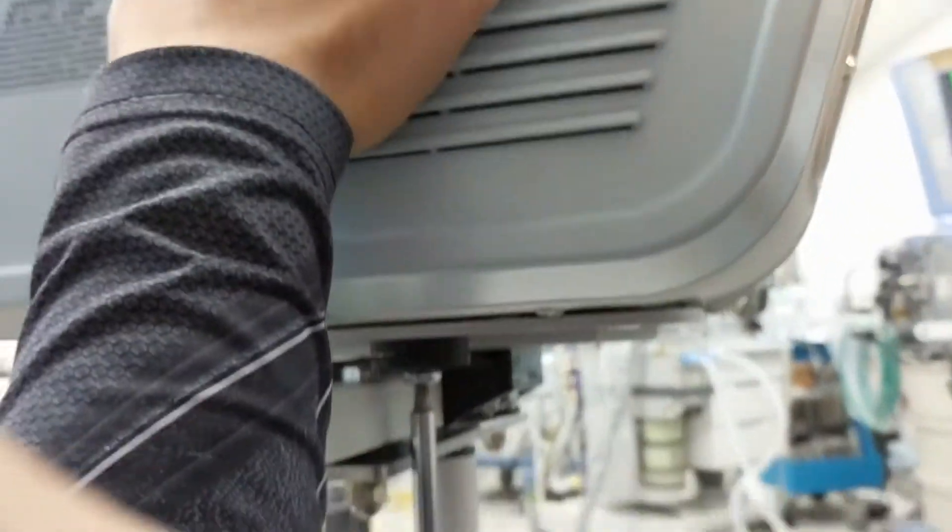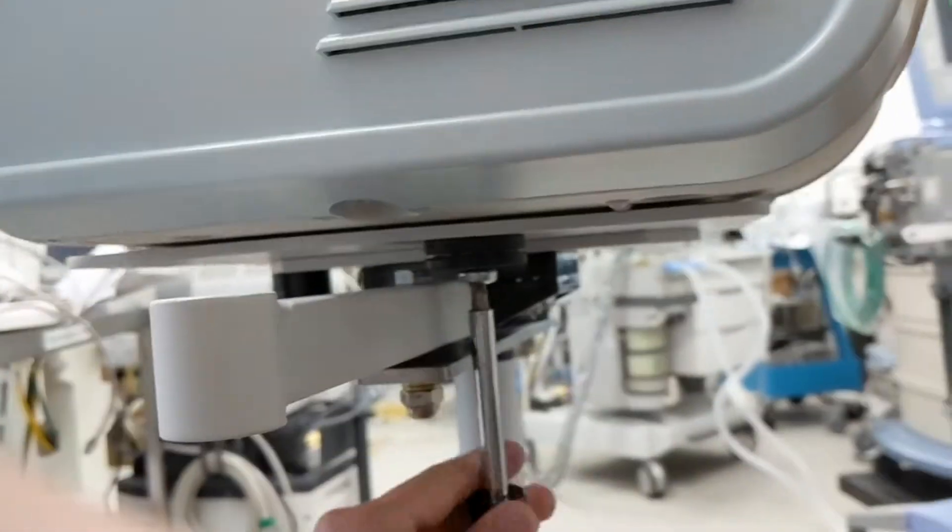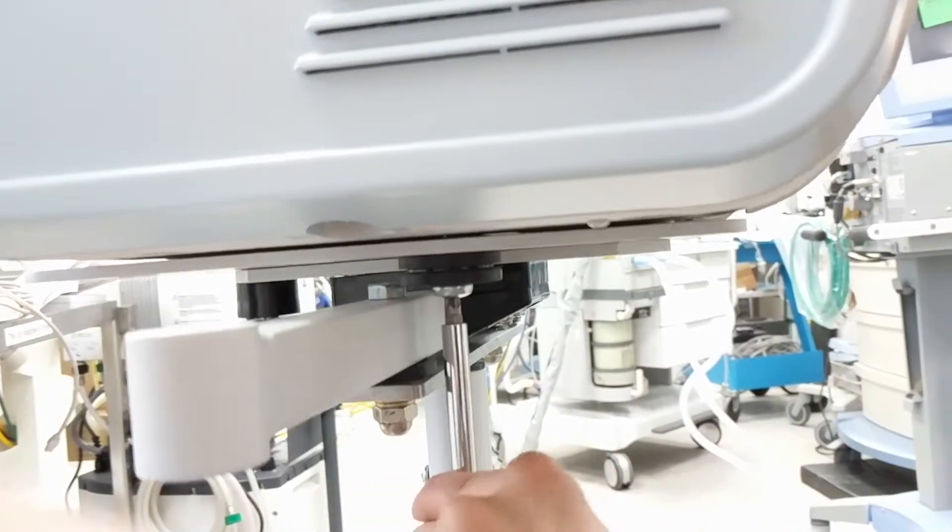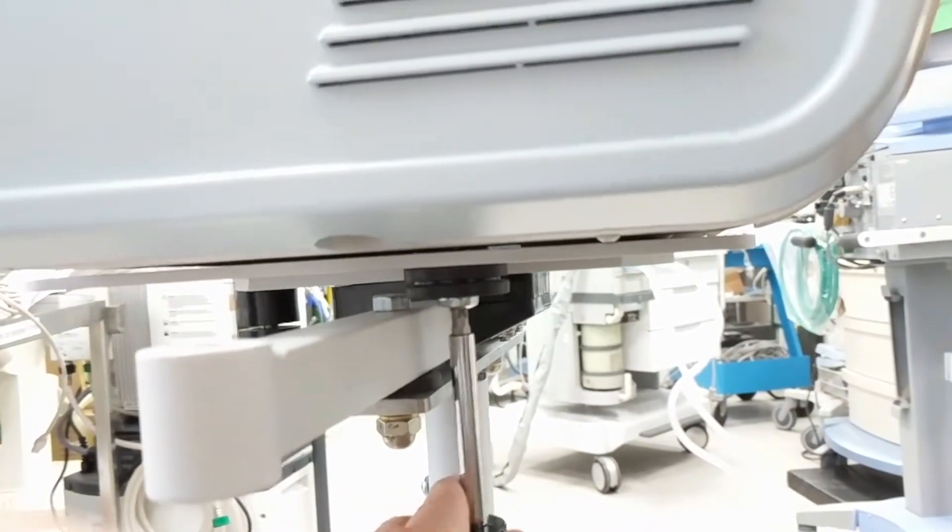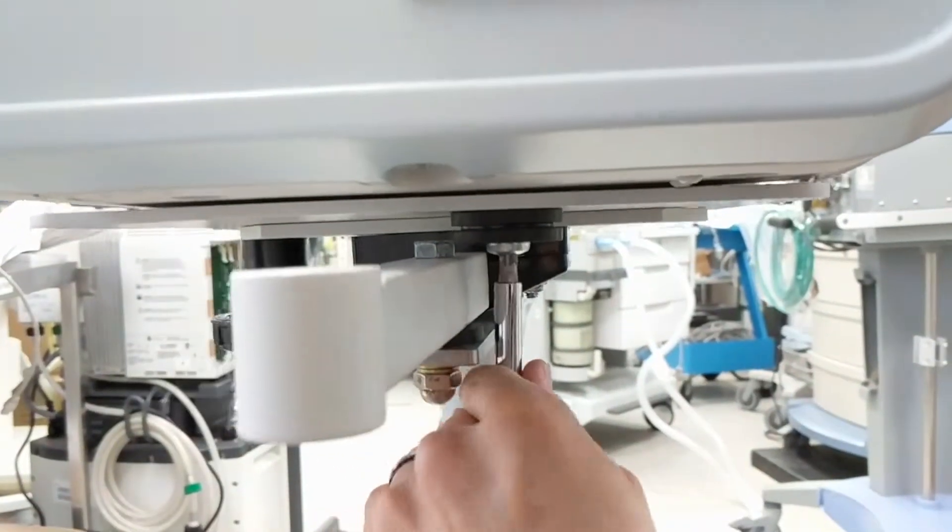It will be a little tight at first because of the rubber gasket here, but you should be able to secure the machine and secure the unit. Right in there.